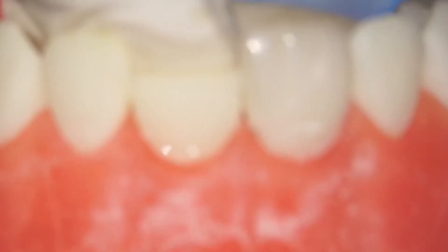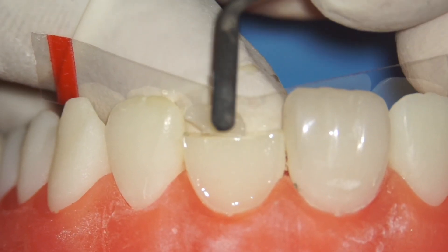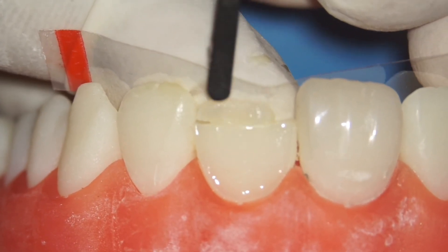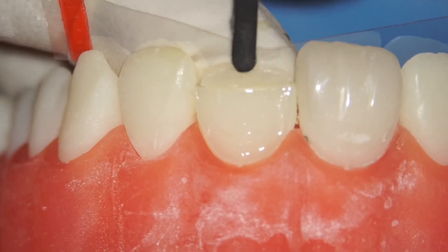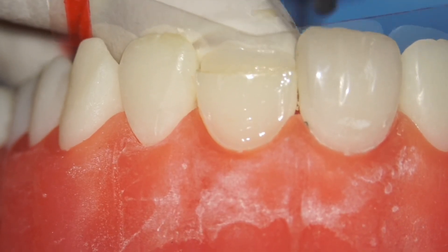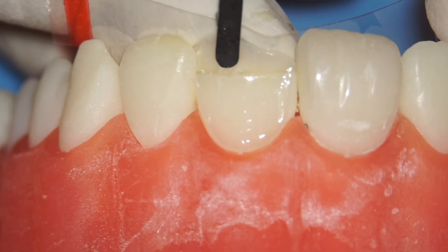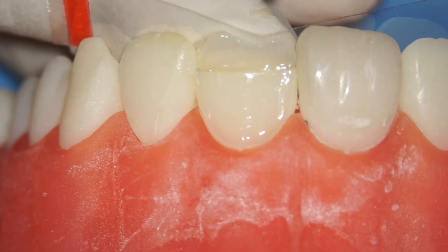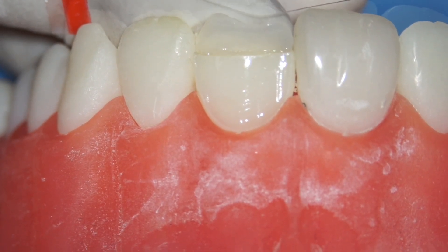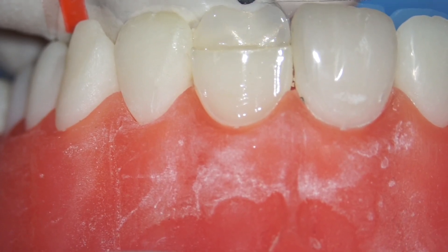I'm going to use A1 from Tokuyama — just place a small amount at the celluloid matrix and start compacting it, compacting downward and upward at the same time. Press it downwards so it's against the celluloid strip, then slowly push it upwards. You want this layer to be about 0.5 to 1 mm thick — if it's 2 mm it's too thick. While compressing the composite, also check to see if you have enough height.